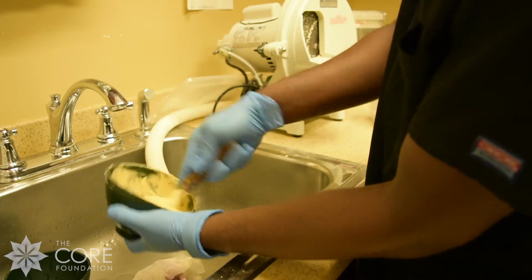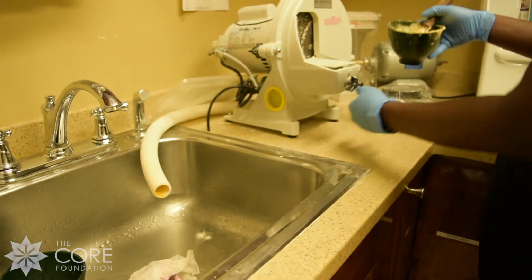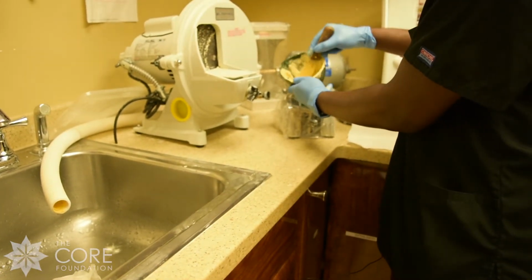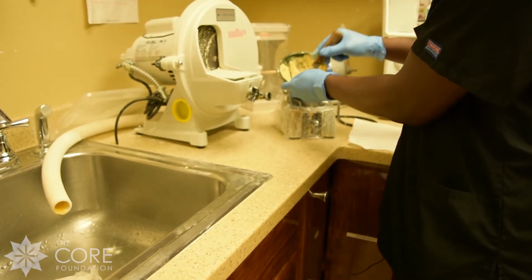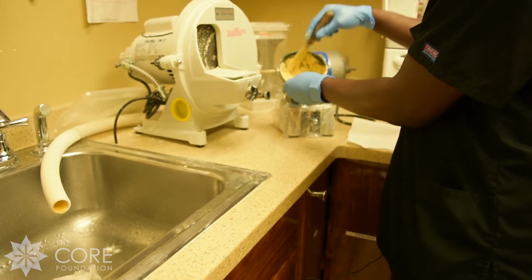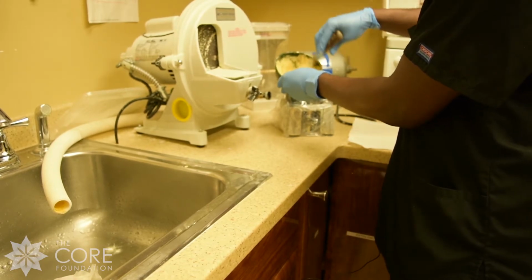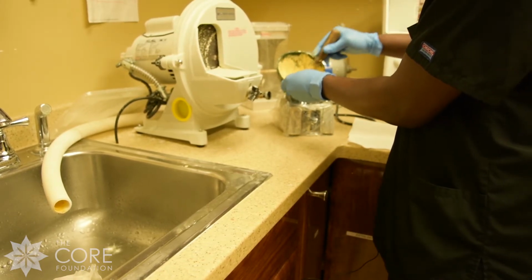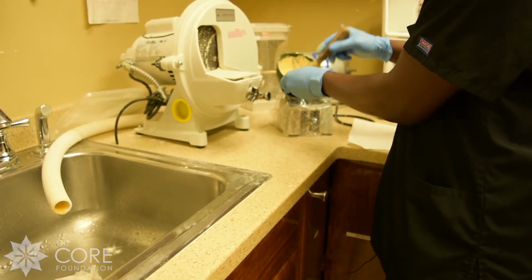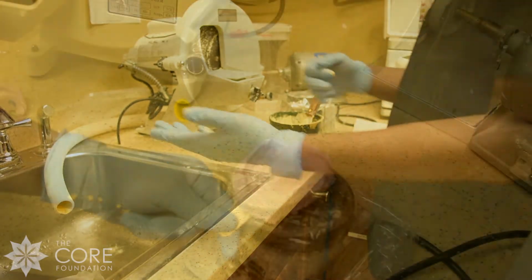And then once you have it all really nice and smooth, you want to bring it over into your shaker. We're going to turn it on right now to make sure we get out all the bubbles from it. So I'll leave it on here for a moment and keep mixing. And as you notice, there are no bubbles right now. We'll turn it off and then we'll fill our impressions.